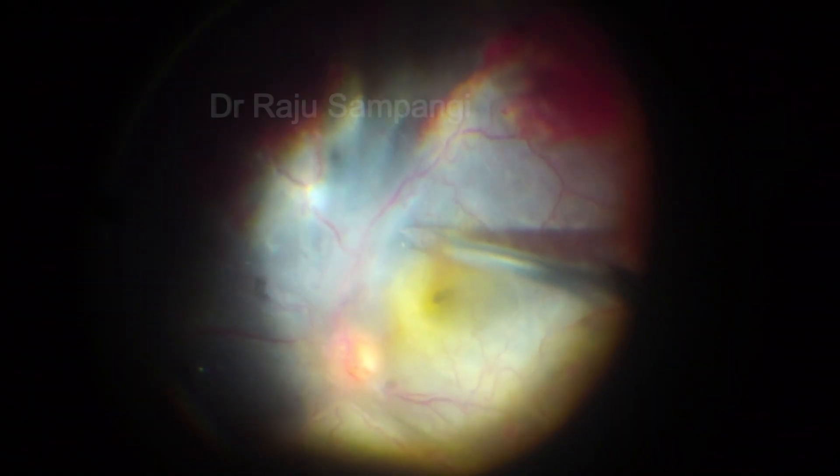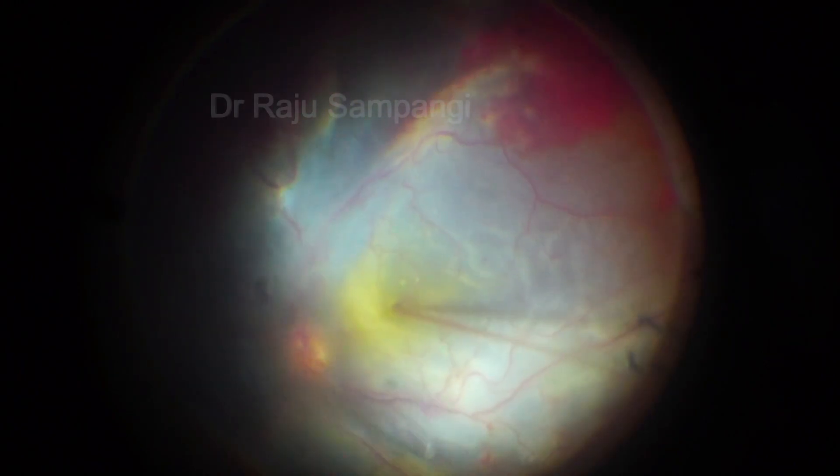A macular hole was also noted on the table. BBG was injected and the ILM was peeled.